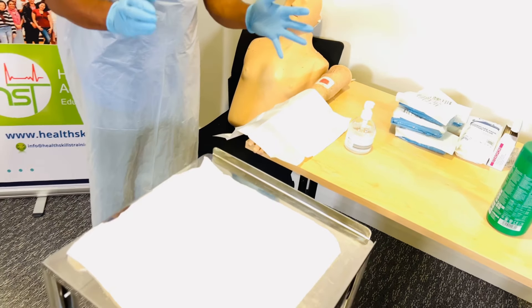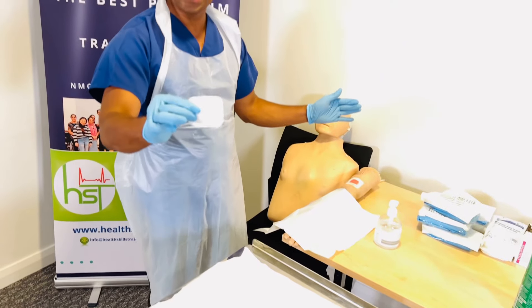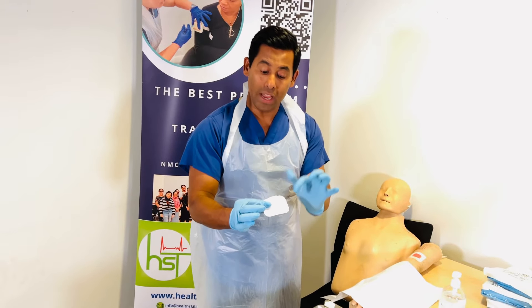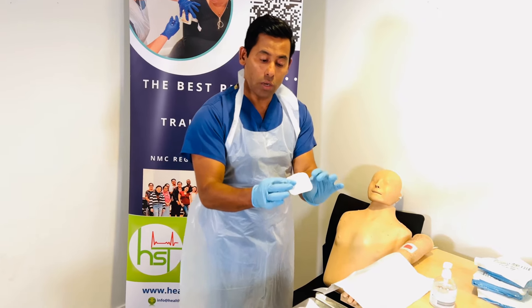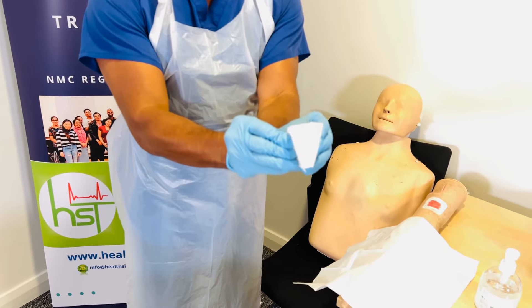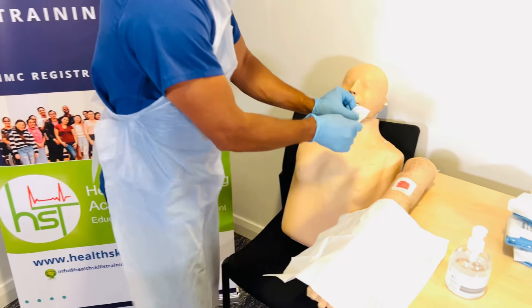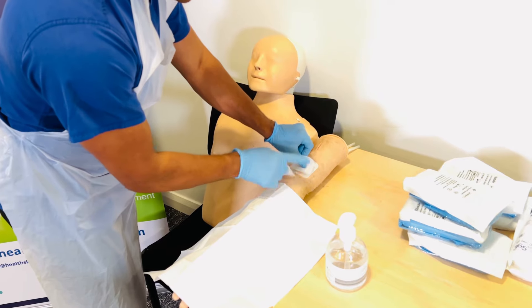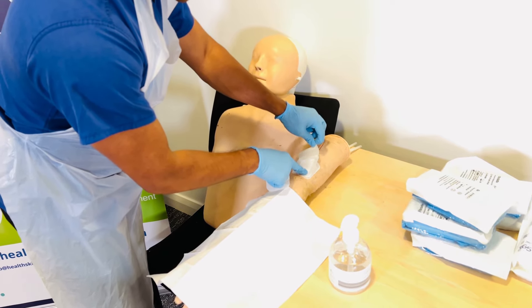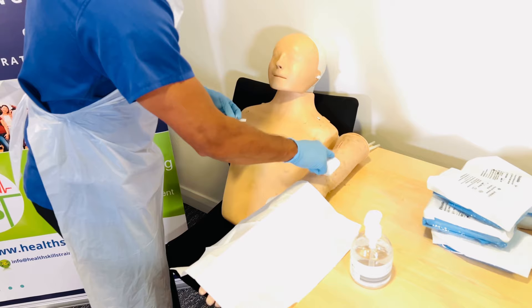Now apply the dressing. The dirty hand stays at the wound; the clean hand picks up the dressing. You can hold the dressing with both hands while it's still covered — just do not touch the inside. Hold it with both hands and gently open the dressing cover. Separate it, making sure the inside is not touched. Apply one side to the wound, attach it, then gently flick the folded part and apply the other side. Tap the sides to make sure the dressing is completely covering the wound.